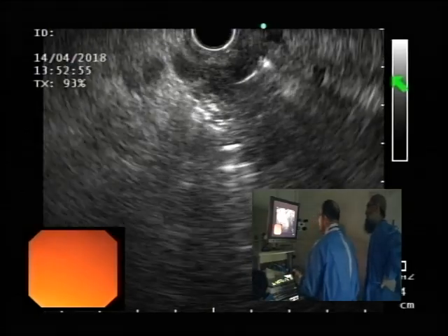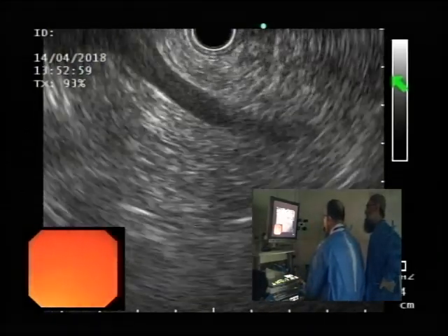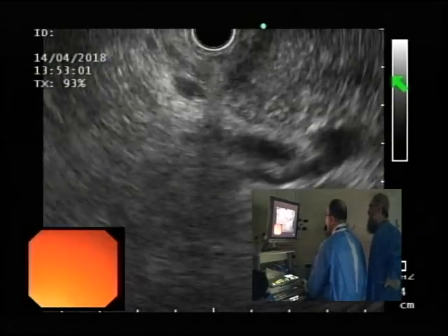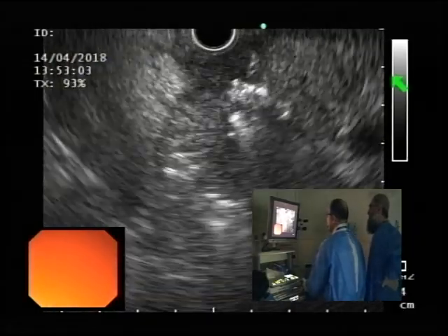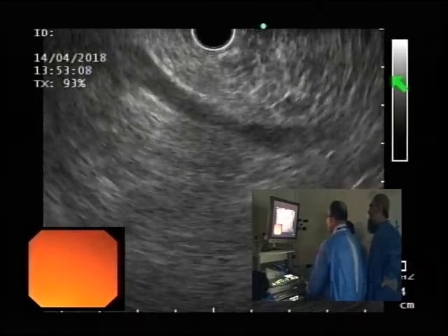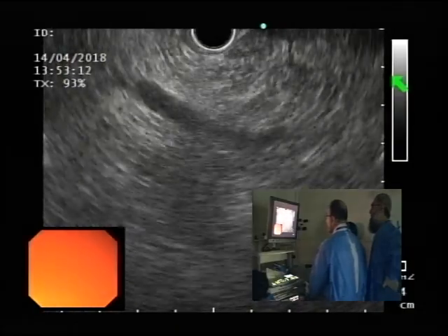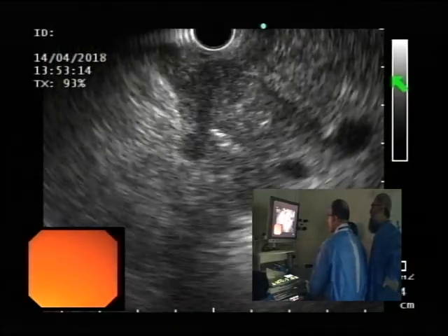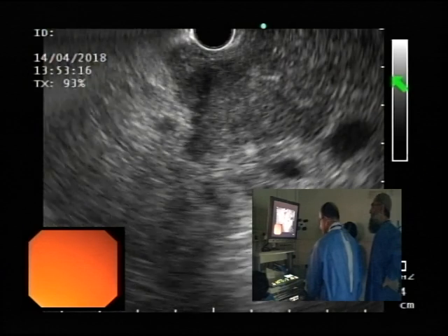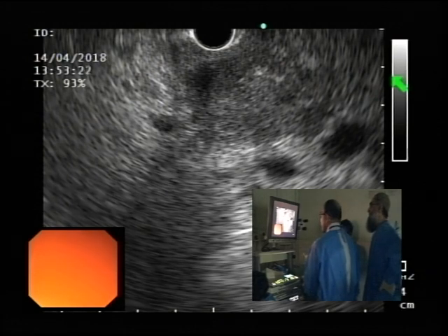We're going to zoom in one. Now we're looking at the mesenteric vessels, and there's the mass. Oh yeah, this is probably an uncinate mass. Right there. So Dr. Saad, is this something that needs to be sampled? What is our plan here?